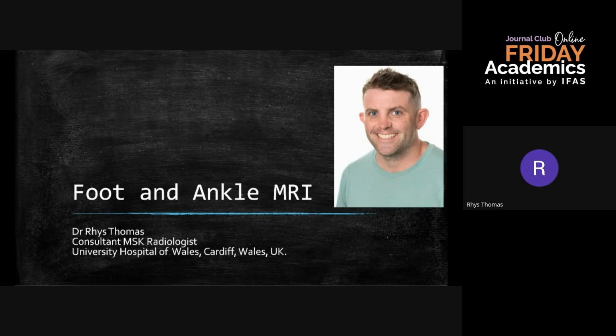So for this evening's presentation, most of my cases are going to involve the adolescent or young ankle, covering trauma and trauma mimics, mainly at the ankle and around the talonavicular and calcaneal cuboid joint, which I think will mix in quite well with the talk we've just had, who's covered everything else, it seems.